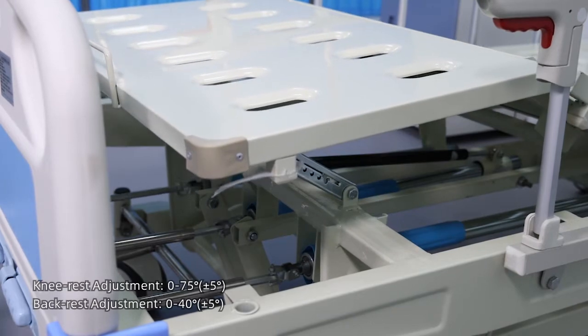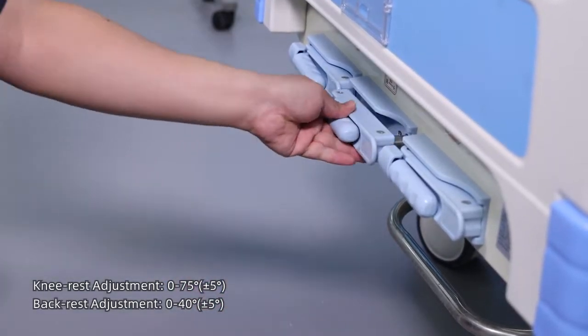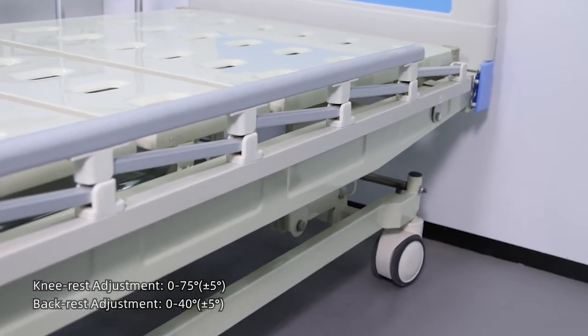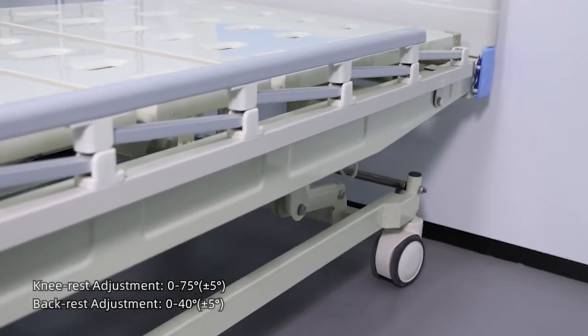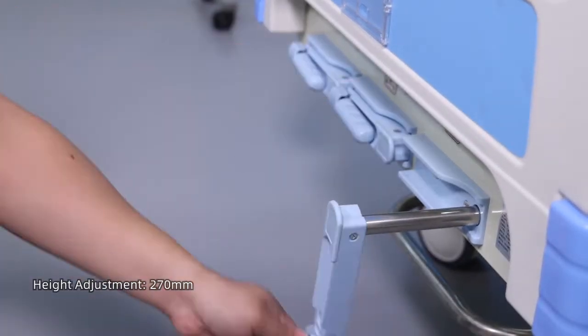Knee rest adjustment: 0 to 75 degrees, positive and negative 5 degrees. Back rest adjustment: 0 to 40 degrees, positive and negative 5 degrees. Height adjustment available.